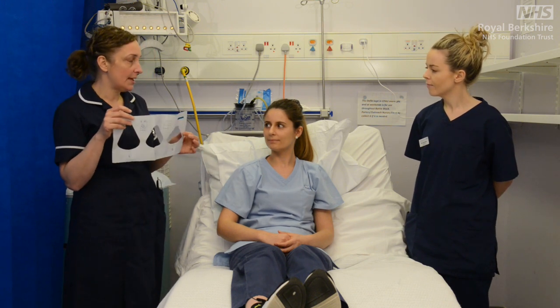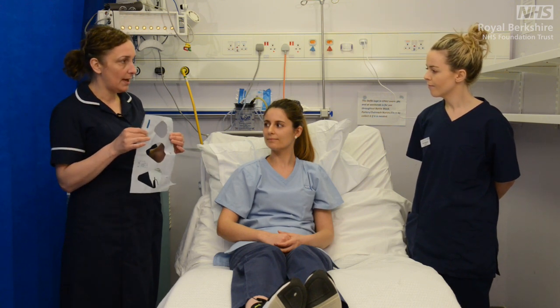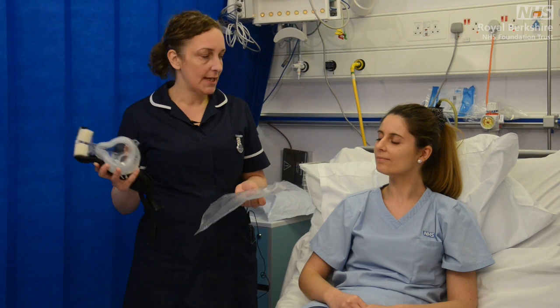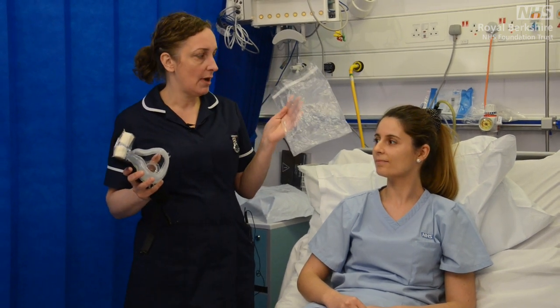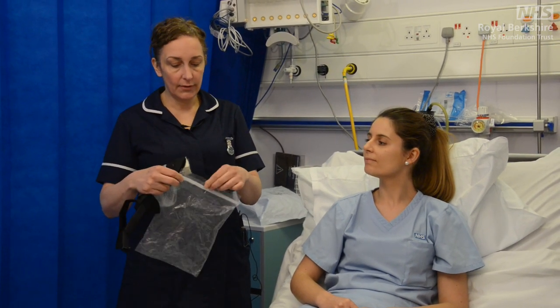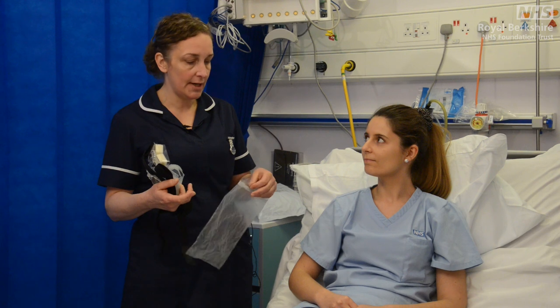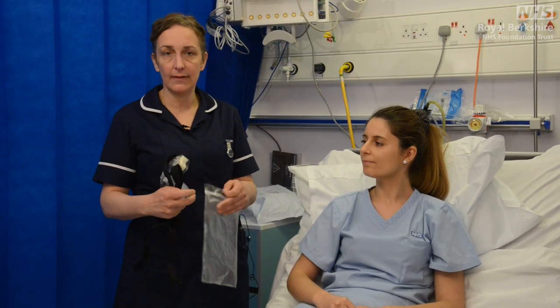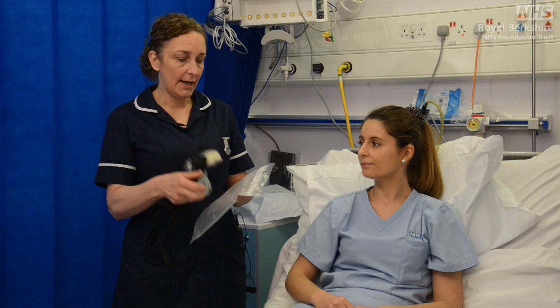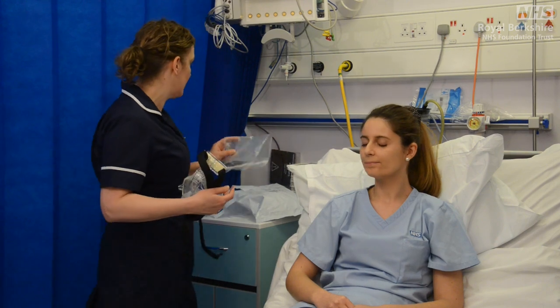We've determined that for this patient we need a small mask, so we can now get the right equipment. We've got the right mask from the equipment cupboard. Inside the packaging, the other thing you'll have is a resealable plastic bag — please don't throw this away. This can be used to store the mask, whether on a temporary basis if we're taking the patient off non-invasive ventilation, or if you're transferring the patient or weaning them off. It keeps it clean and serves infection control purposes as well, so keep that to one side.